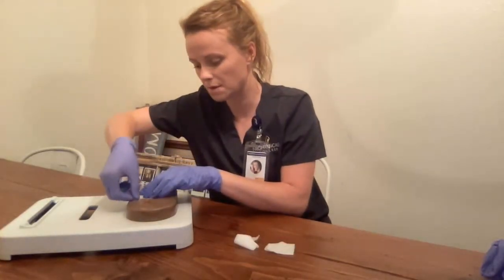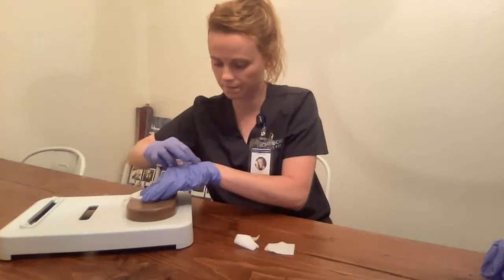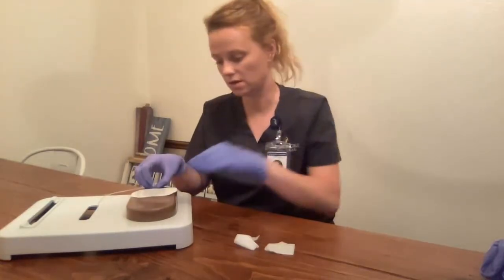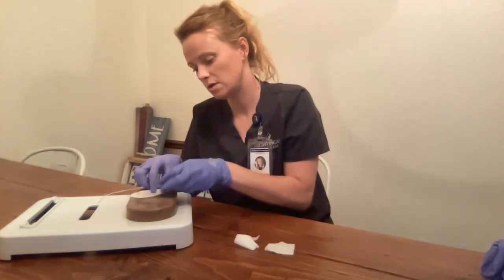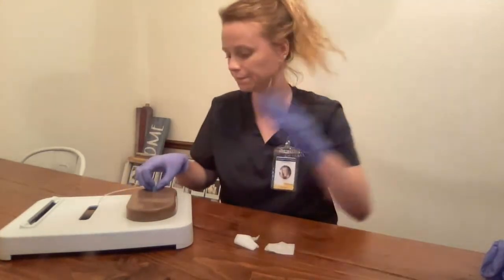I'm going to come over here. I'm going to first remove the tape that is on my patient's arm here, slowly and gently. While stabilizing the IV here, I'm going to slowly remove the dressing. Dispose of that.